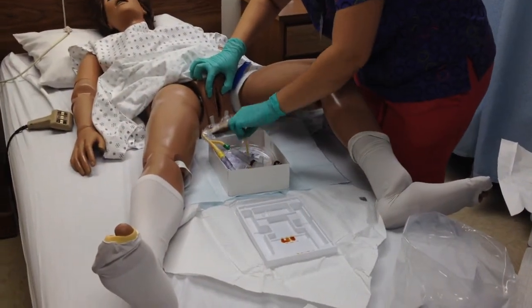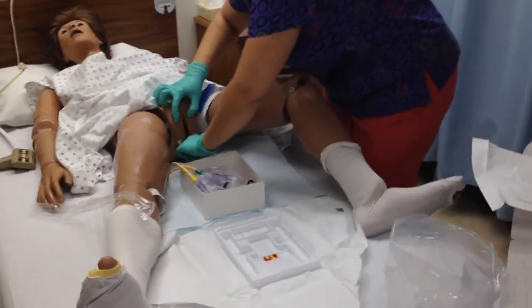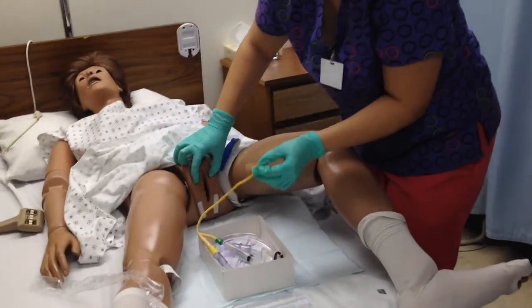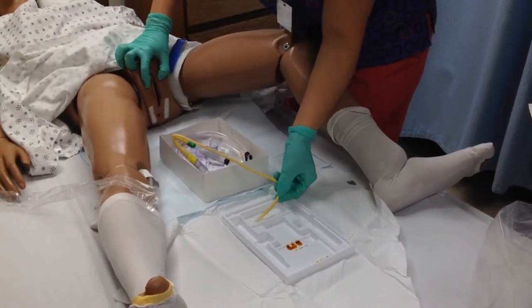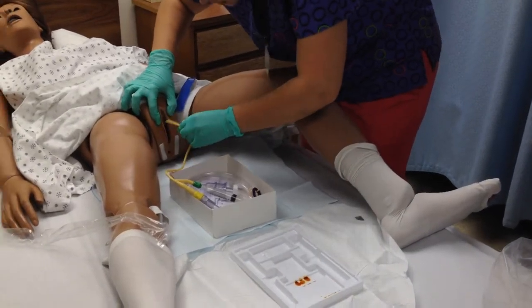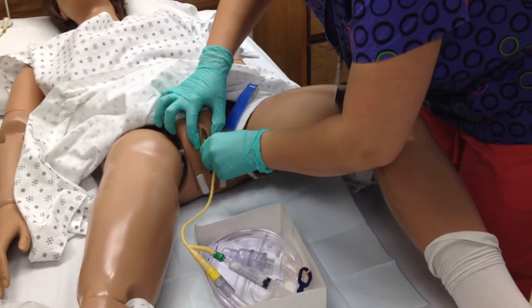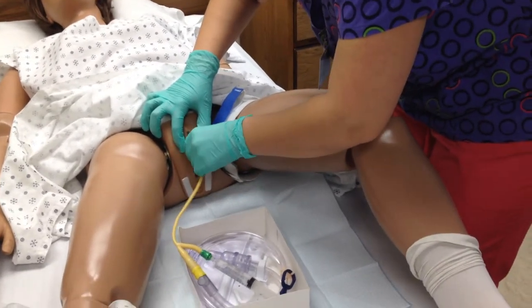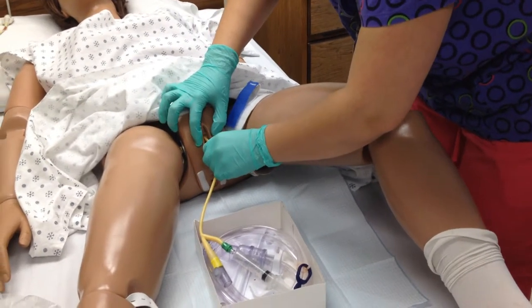Now I'm going to lubricate my tip. Keep the meatus open. Insert until I see urine. And then after that, I would insert another inch.